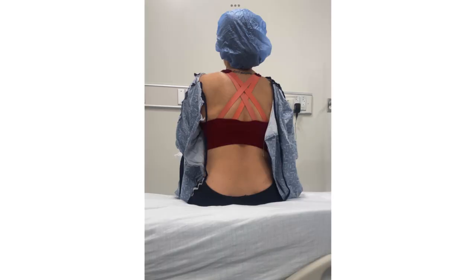When the patient indicates that they are ready for an epidural, have them sit up on the edge of the bed. Make sure that the patient is not sitting up on the crack of the bed. Make sure they're away from the crack of the bed so that their hips are midline and they are not leaning one way or the other.